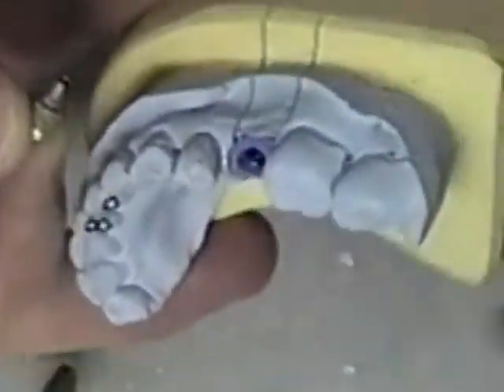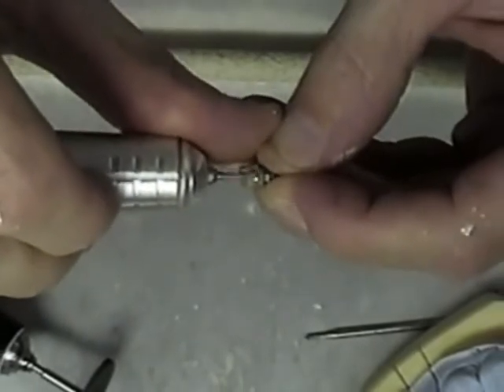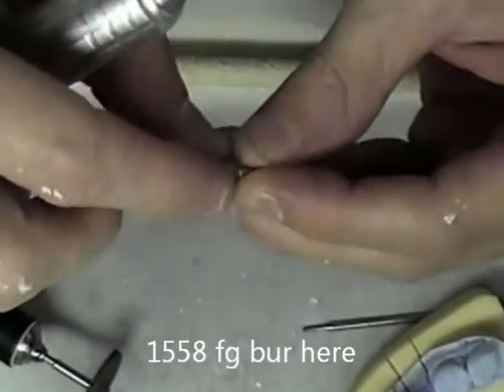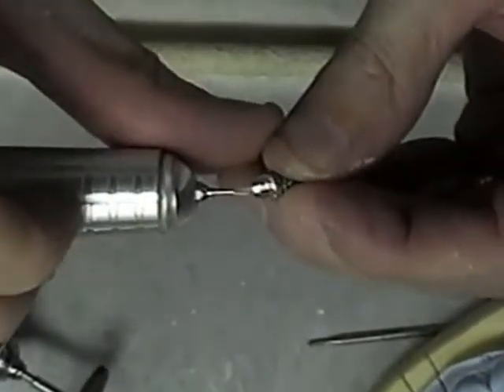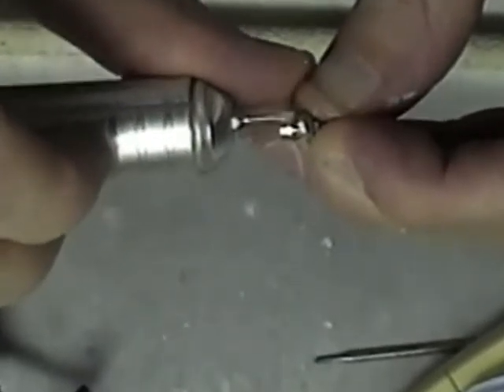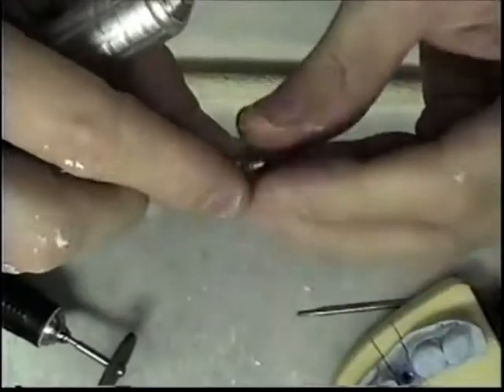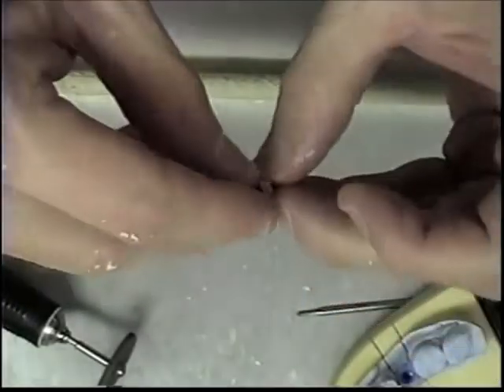Right now I'm above the gingiva, so I'm going to mark a red line on this. I'm going to take my high speed with the carbide burr and shape my margin, dropping the margin as well — just shaping a little chamfer margin. At this same point I'm concentrating on not creating an undercut, so I'll take some off of the buccal as well. I do this a little bit at a time.